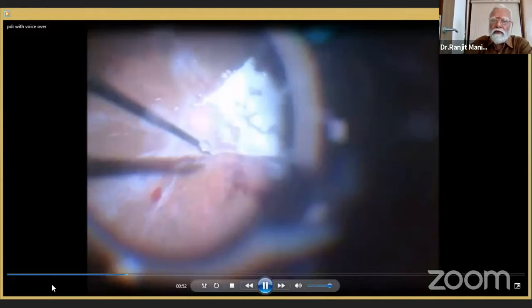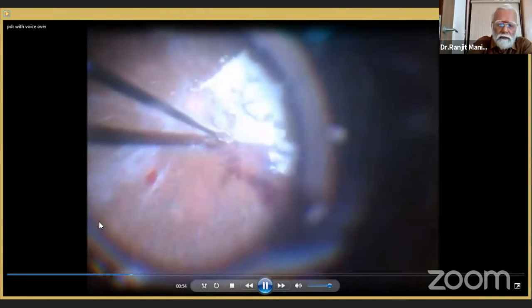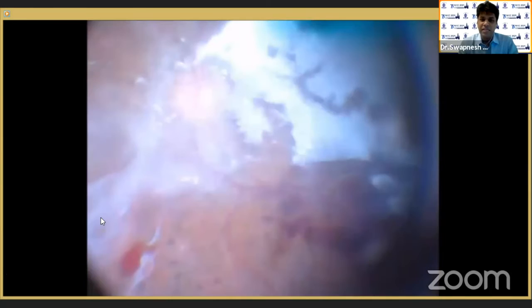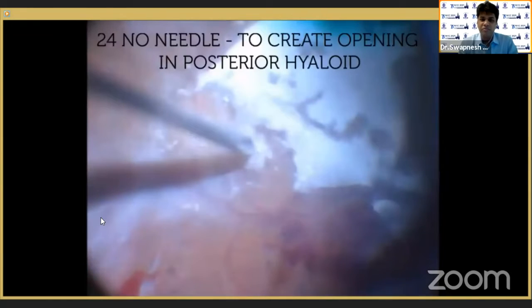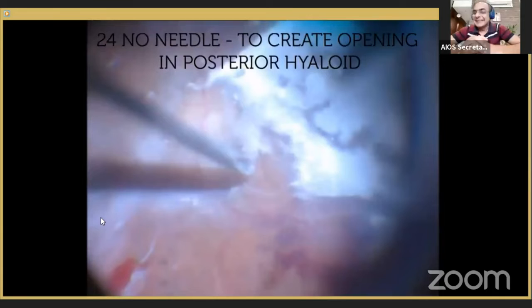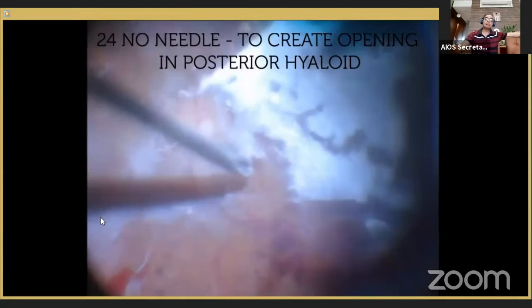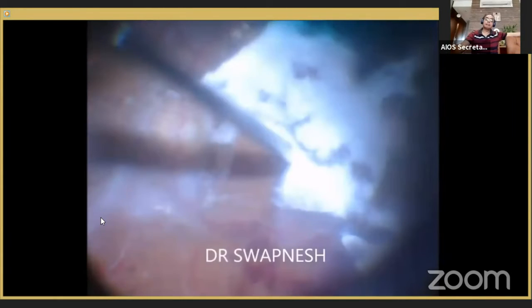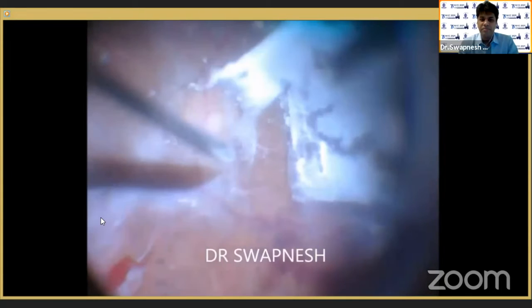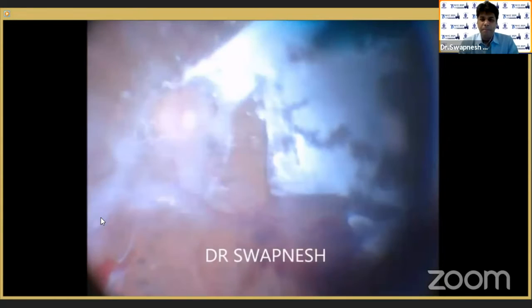The flat tabletop configuration, dissection, and vitroschisis are the difficulties. In spite of using force, it was difficult, and I had to resort to using a 24-gauge needle to create an opening and cleavage plane using the forceps.